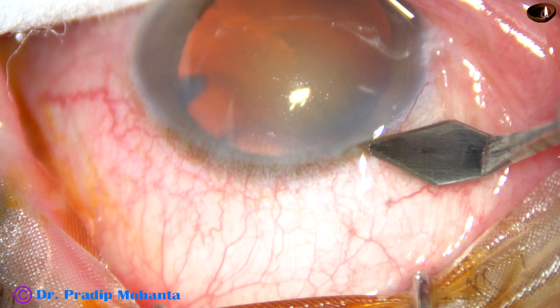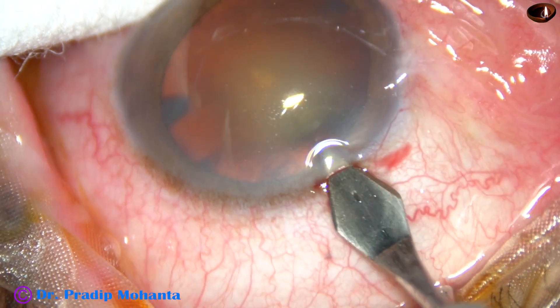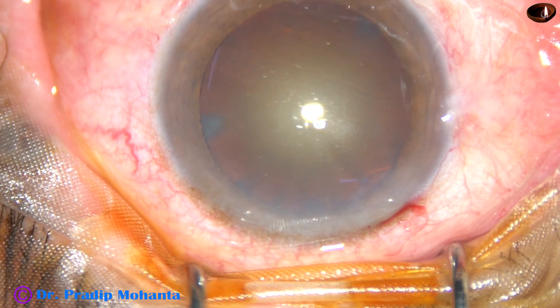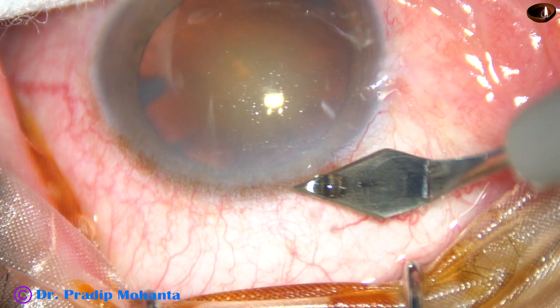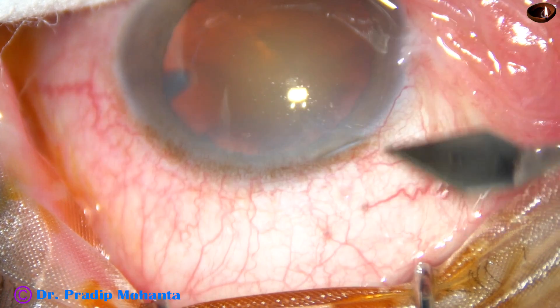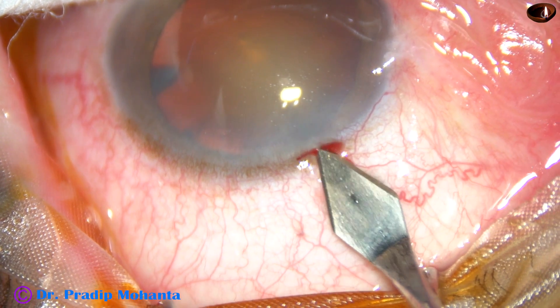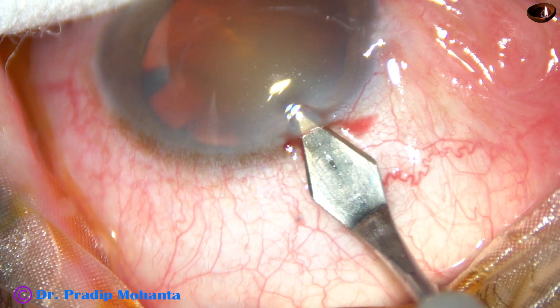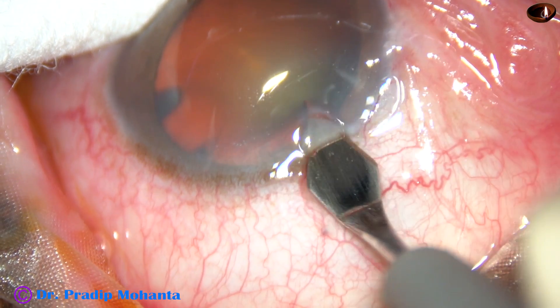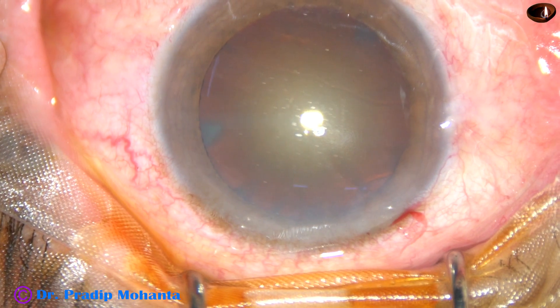This is another case. This is the main incision — first groove, engage, and then go downward. Let us see this in slow motion. With the blade of the keratome, make this groove on the posterior aspect of the limbus involving some capillaries. Now engage the tip at the floor of the groove, go forward, and then go downward. Don't make a very long tunnel and don't make a very short tunnel — this is ideal.